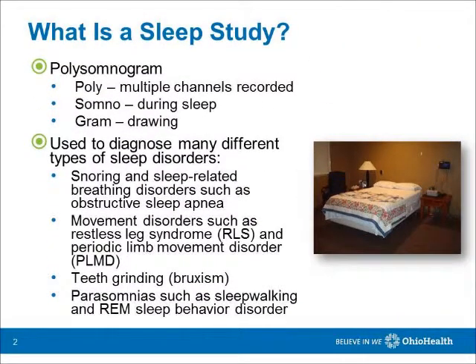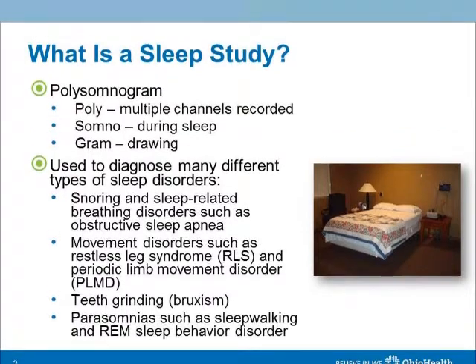A sleep study, or polysomnogram, is a medical test where various biological signals are recorded in order to detect a wide variety of sleep disorders. Some of the most common sleep disorders are obstructive sleep apnea, or the repeated cessation of breathing while asleep, and limb movement disorders, such as restless leg syndrome.